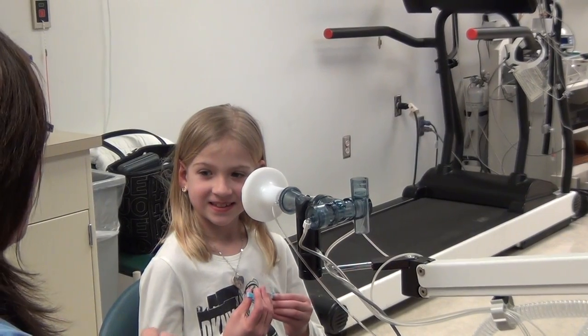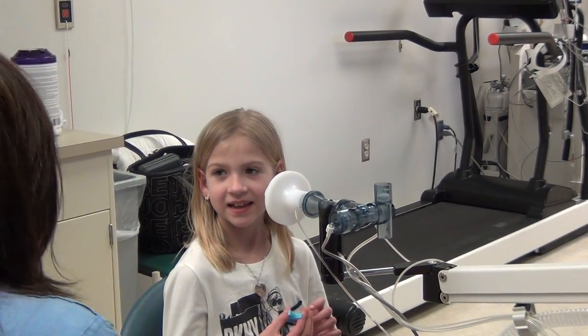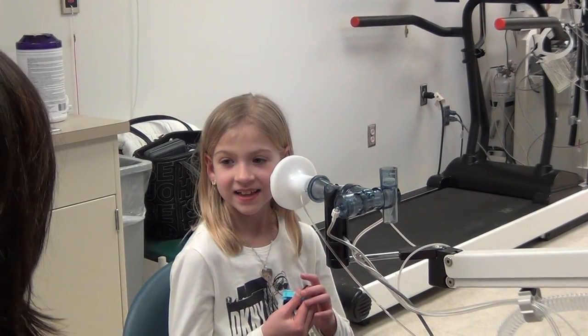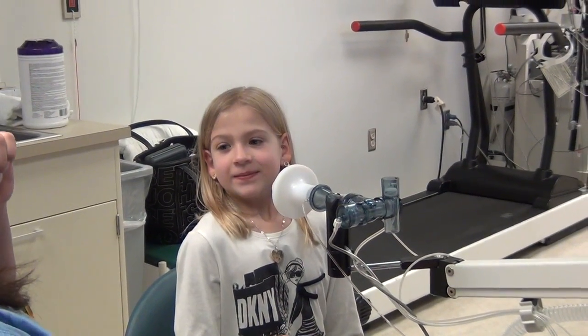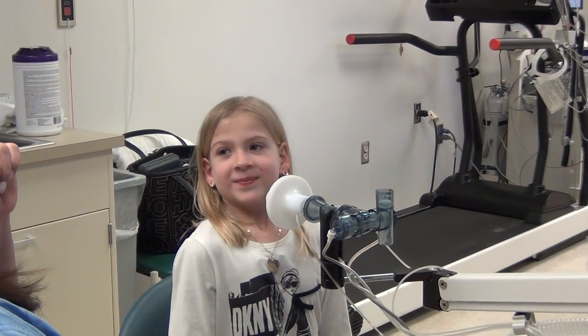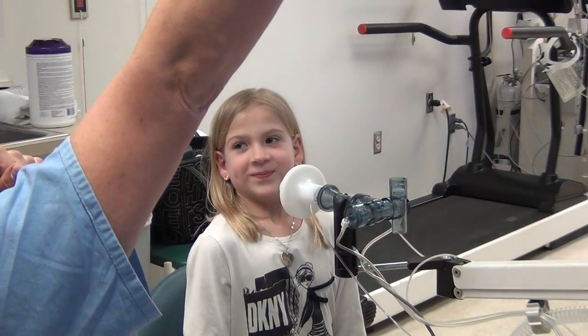Start off with breathing normal. Once I see you on my computer here, I'm going to say when you're ready, take a big breath in. It's got to be big and fill up your lungs. Immediately you're going to blast it out — say there's a rocket in there and you've got to blow it up to the moon.